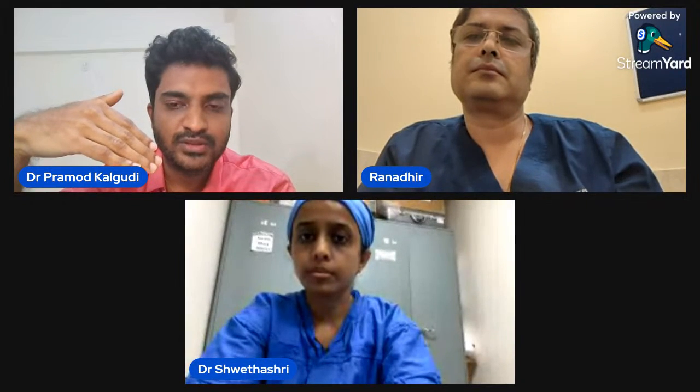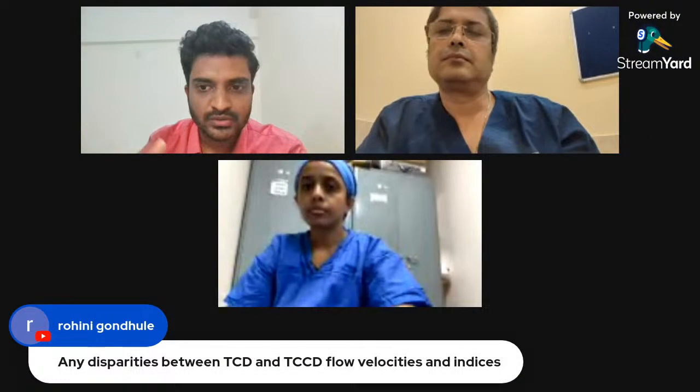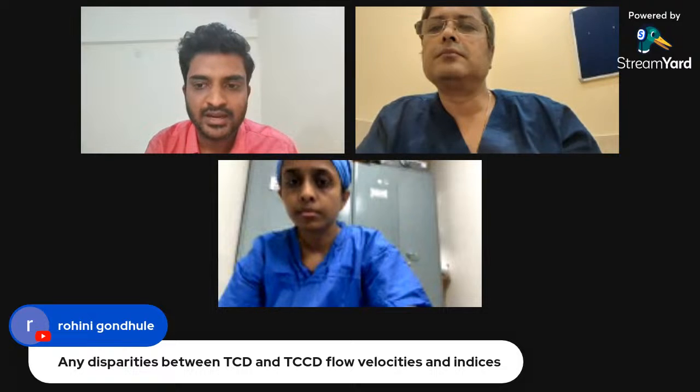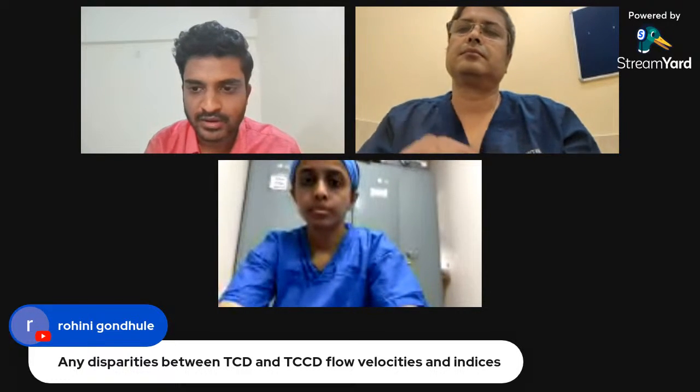Whereas with TCCD, the flow velocities are still within the range. But as I said, if your angle is somewhere in between, or if it is more than 60 degrees, you get a very erroneous value. So that needs to be kept in mind when we speak of disparity between TCD and TCCD flows and indices. Indices will be the same, more or less.